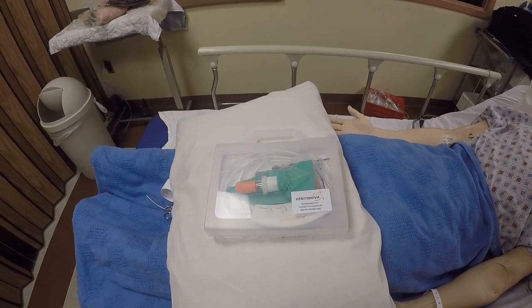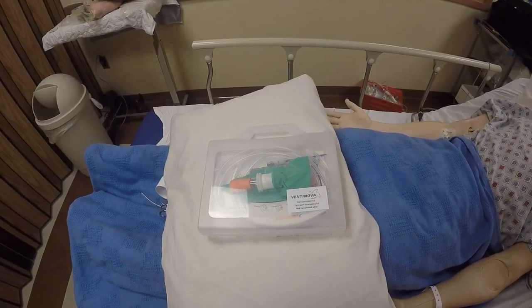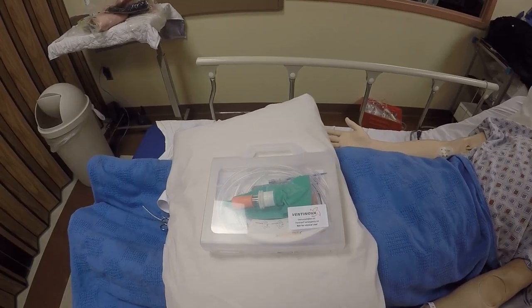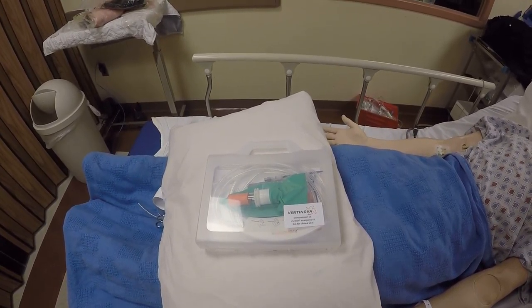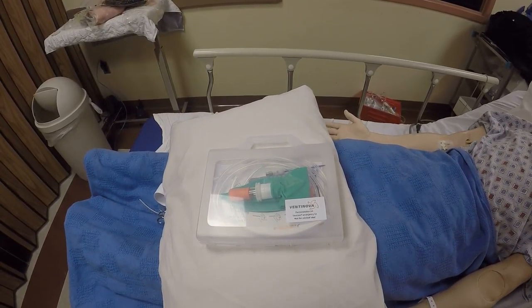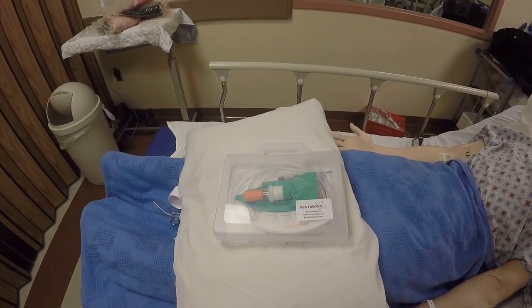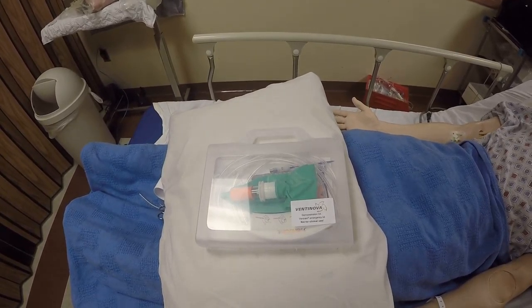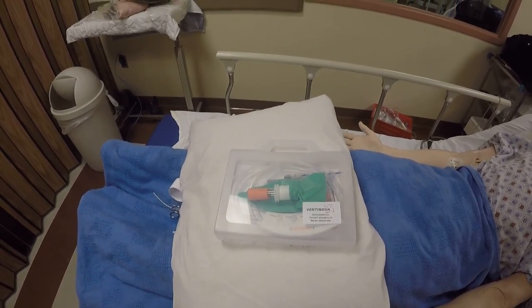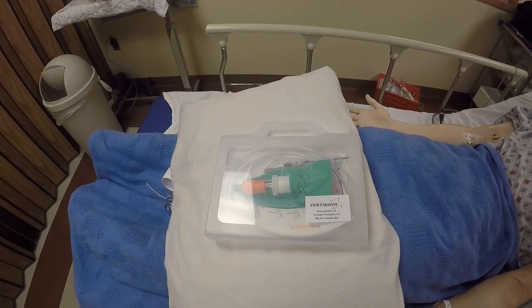I used to always tell my residents: using a jimmy-rigged 16-gauge needle with a catheter connected to a 3cc syringe, jimmy-rigged with a 7.5 endotracheal tube connector, was the MacGyver way of making a needle crike. Using it on a BVM was a way that people would try to teach it. In my experience, it wasn't successful — at least on mannequin or simulated use. Trying to use high-flow with a cannula also was not feasible for me, and I didn't believe that it worked.